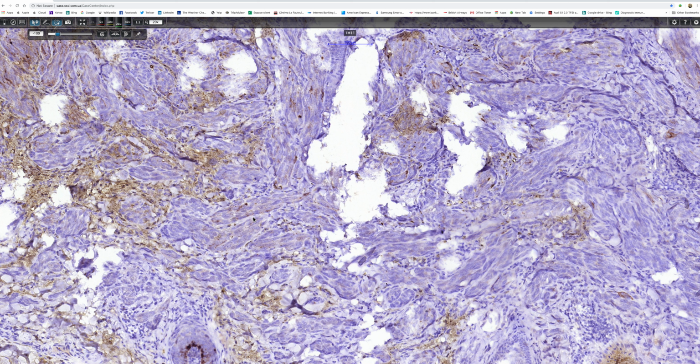Now you might wonder about the mitotic activity in the first one, and my thoughts about that are, firstly, they were all very superficial. Secondly, it was uncertain which ones were melanocytic and which ones were keratinocytic, because there was a lot of pseudoepitheliomatous hyperplasia. But what was important was we didn't see any deep mitoses, and the lesion was symmetrical, circumscribed, and matured with depth. And that being the case, I think we don't need to worry about it.